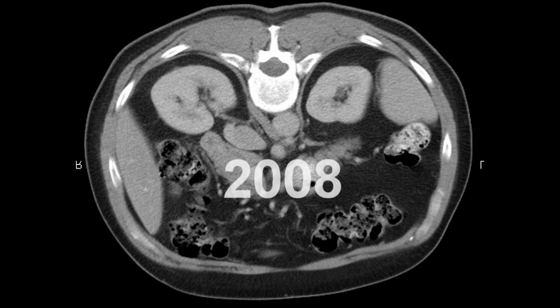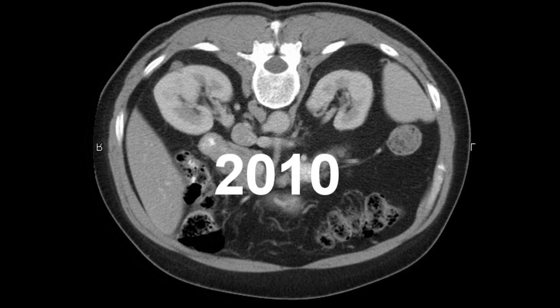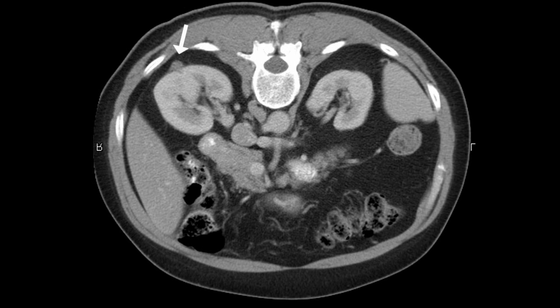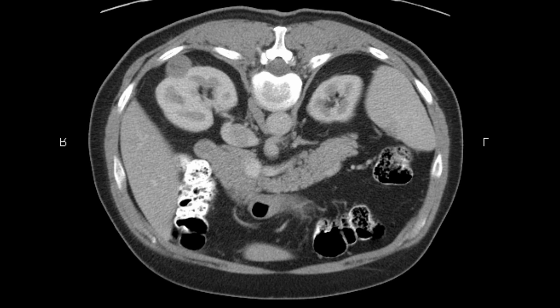This patient, on the other hand, had a scan back in 2008 showing the right kidney to be fairly normal. A follow-up scan in 2010 showed a small cortical lesion, very nonspecific. Finally, in 2013, there is definite interval growth of this isolated mass lesion on the posterior cortex of the right kidney, measuring approximately 2.7 by 2.1 centimeters. No other lesions were found in the body, so this would be a great lesion for radio frequency ablation.